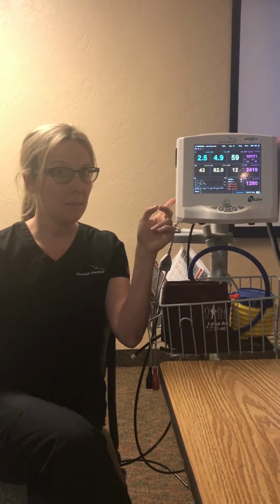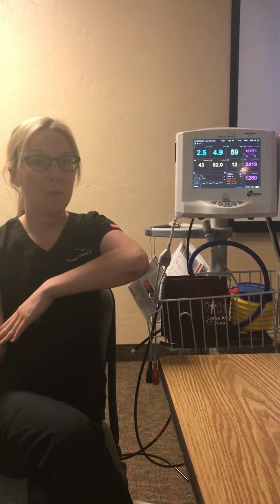If you have any extra fluids like NS at 250 or something like that, turn to TKO. Lay the patient up for 3 minutes, get an average SVI baseline. Then lay them flat, lift up the legs, put the pillow underneath the legs. Don't let the patient lift his or her legs up themselves. We want to do it for them and put the pillow under. You'll need another nurse or a CNA to help, because if the patient lifts up their legs, they could be changing their vascular tone by vagaling.